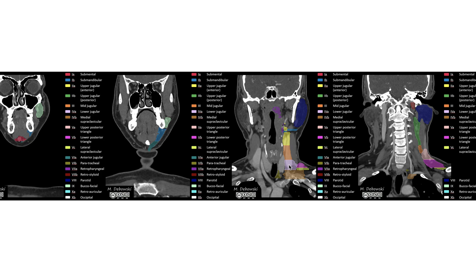Level 5, which is the posterior triangle, can be seen here and here. And then level 6, which is the anterior compartment, can be seen here.